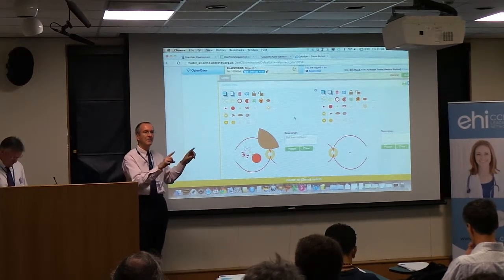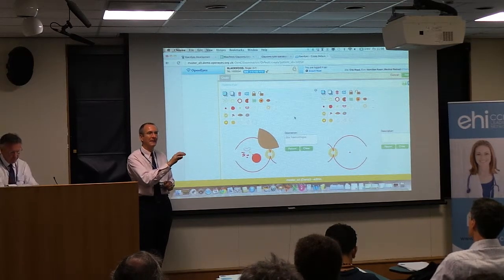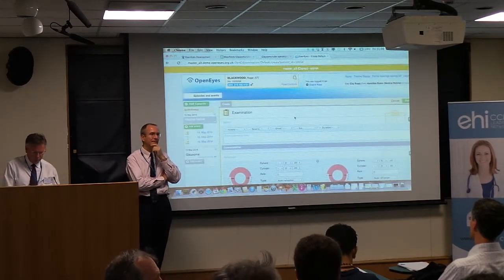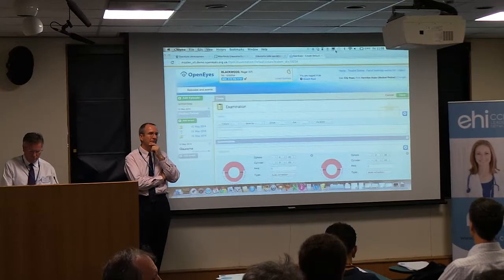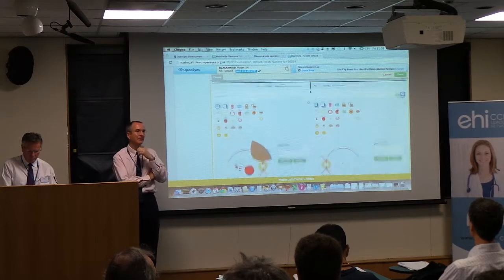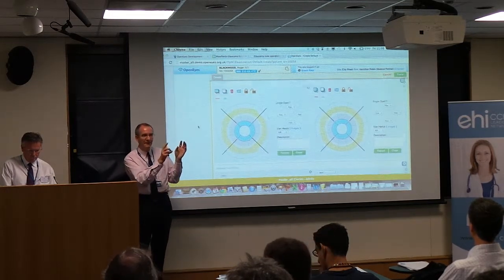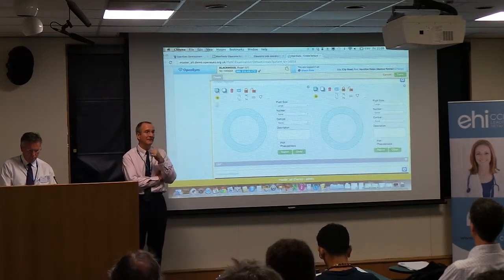So when you log in, you've got an inbox of requests to see certain patients and comment. That's going to be a very powerful way of allowing more efficient use of consultants and digital techniques. They'd actually centralise their reporting of retinal screening, so that technicians took the photographs at the satellite, and they're essentially reported by the consultant. Yes, and that's exactly the point, because it's a very efficient use. We don't need a consultant out there, a very expensive skill set, just looking at retina. Someone else can do that. They need to make decisions, and they can do that at or on the beach.